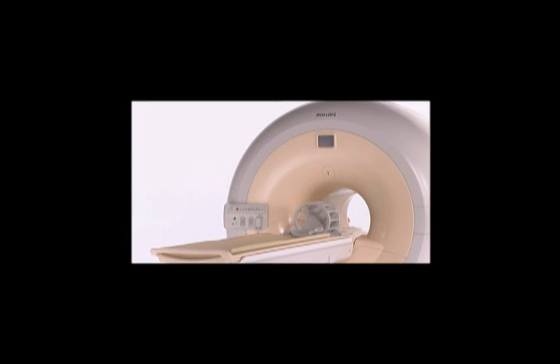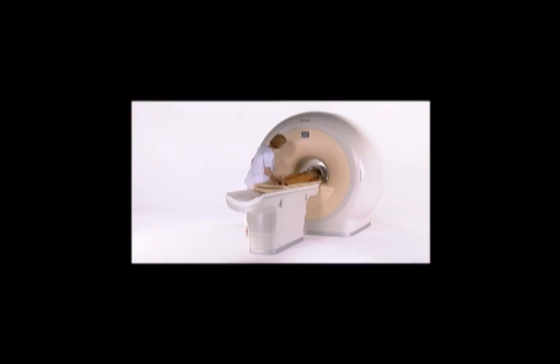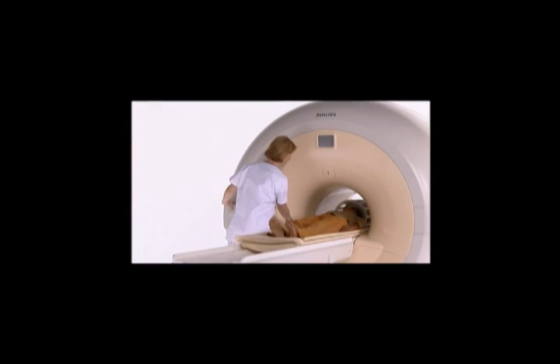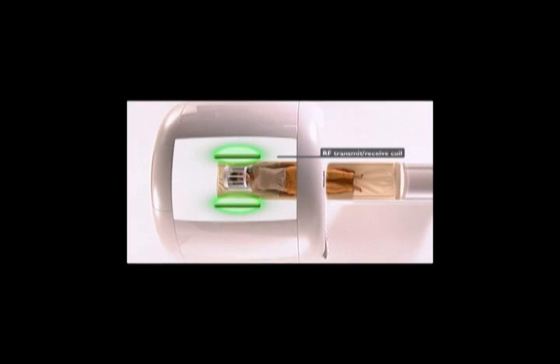To be able to image protons in a large volume, it is important for the applied RF energy to be homogeneous over the whole region of interest. For this reason, a large RF transmit and receive coil, the RF body coil, is built into the scanner. The region of interest is placed in the center of the RF body coil.